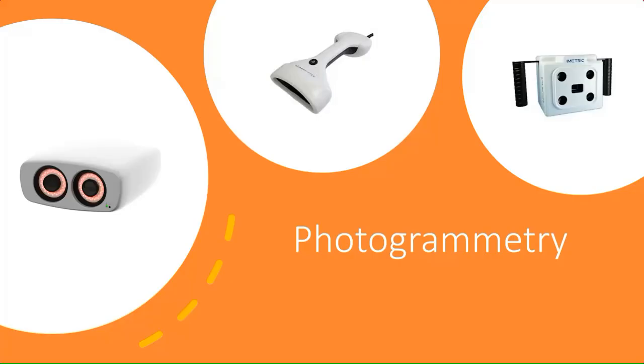We picked this as our starting point because this has really been the biggest gap. What we see in the digital workflow is it's easy to get equipment in an office. It's really difficult to get the laboratory support in some of these digital capabilities. So we want to help you help your customers. That's what we're here as a resource for you.